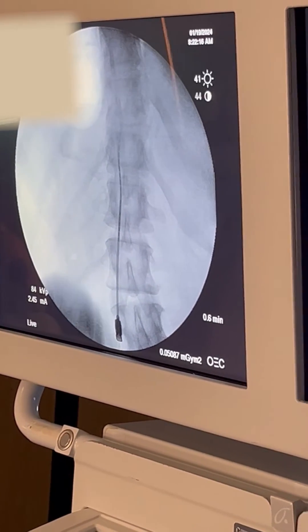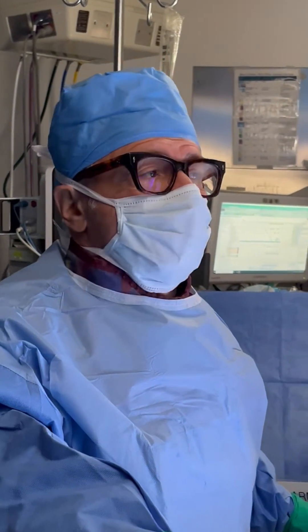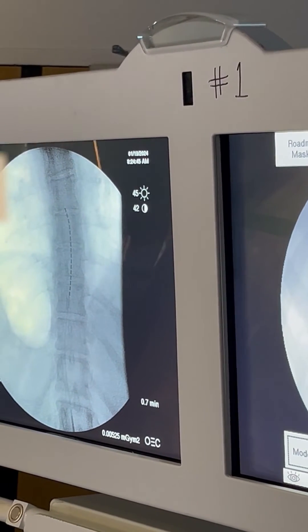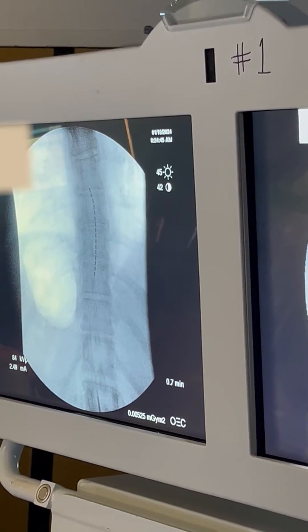You can see the catheter is moving and you can actually steer it. Now we're at about T7, T8 — that's the thoracic area. You can see it up on the screen. Now we'll take a lateral x-ray to make sure that we're also in the proper position from right to left.